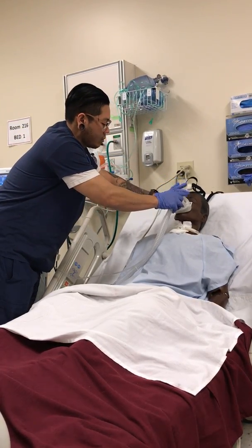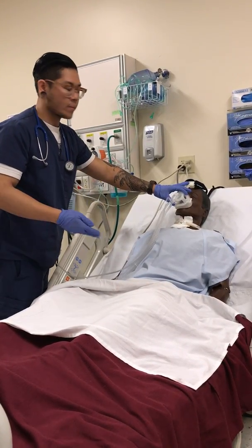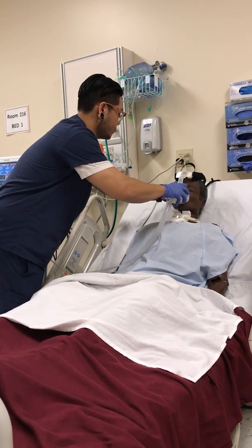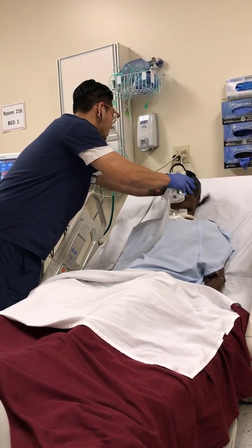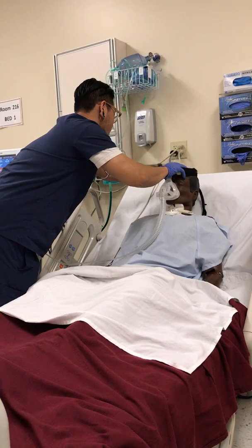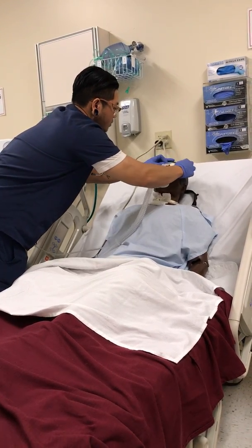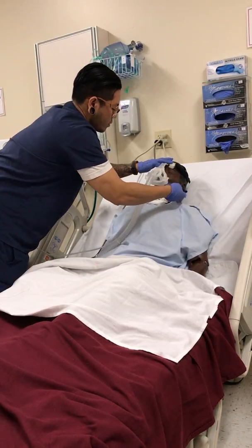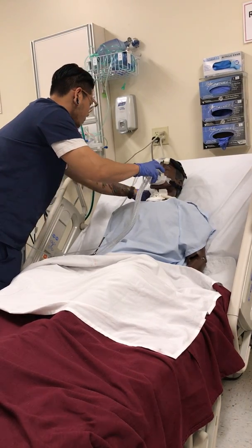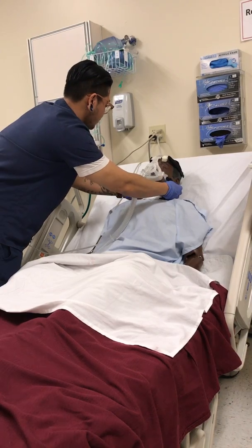So you hold it there. Let him breathe, inhale and exhale, and get used to it. And then when the patient is okay, I'm going to strap this on now, okay? Go. So it's still pretty loose.